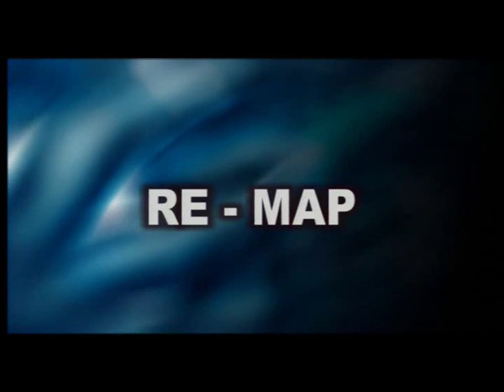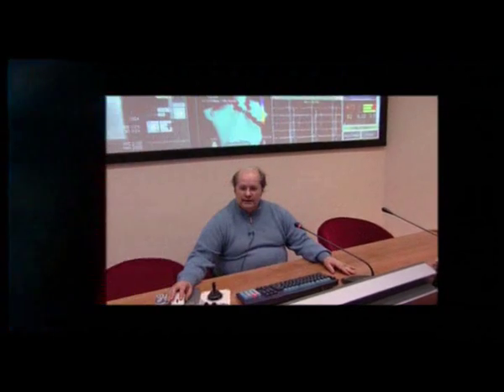The ablation phase of the procedure is finished. Now we start the remapping. This is a remote procedure and I want to continue staying in the teaching room to share the procedure with the audience. We are now starting the remap of this procedure.